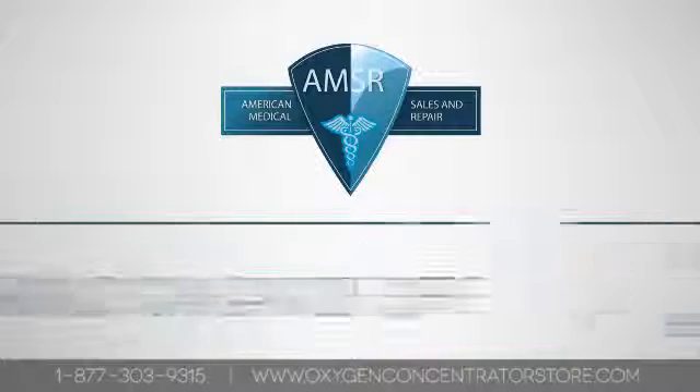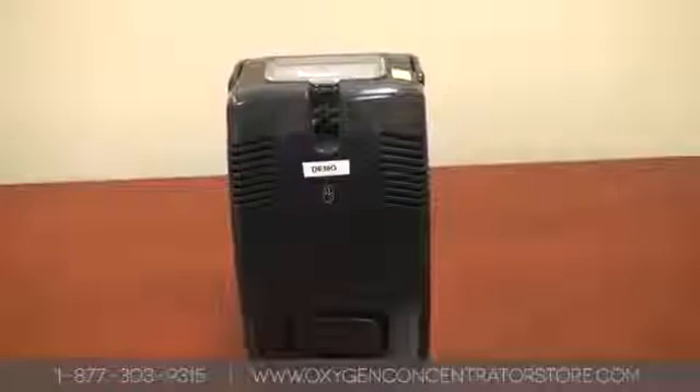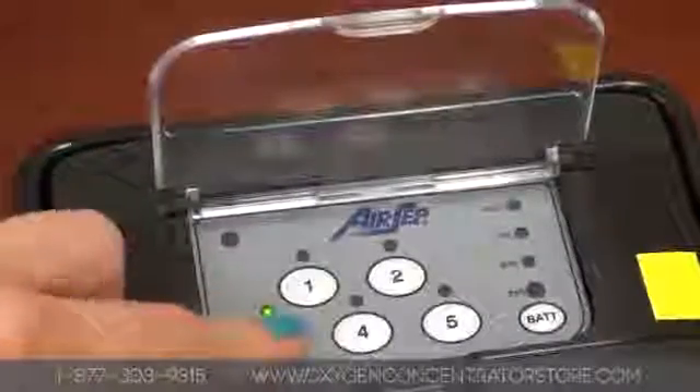Welcome to American Medical, offering the highest quality brands of home and portable oxygen concentrators. This video will show you how to operate your AirSep Freestyle 5 Oxygen Concentrator.